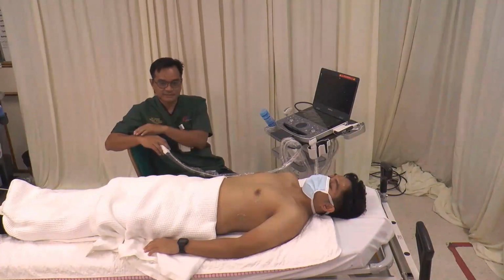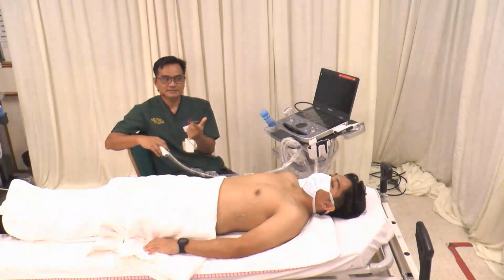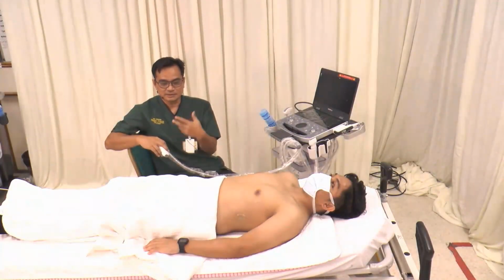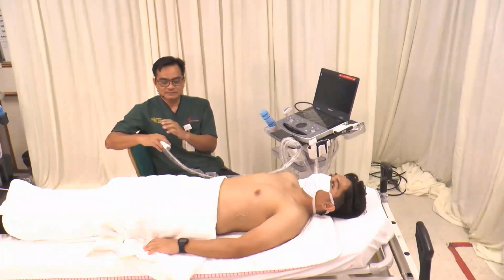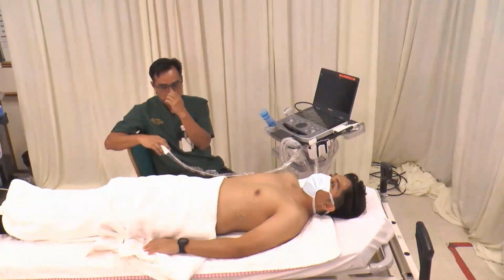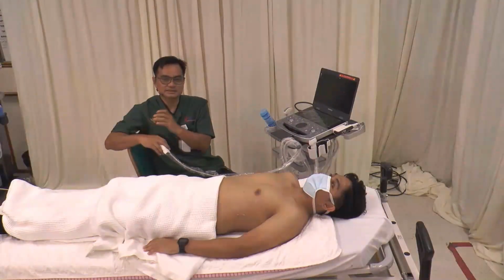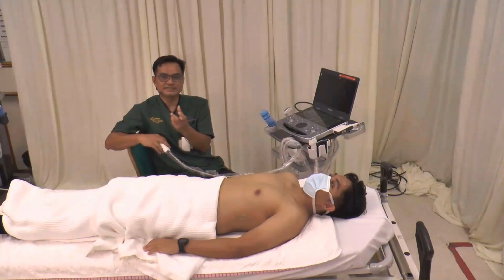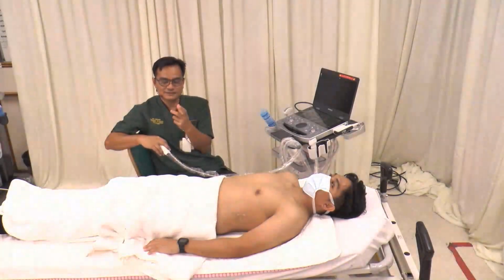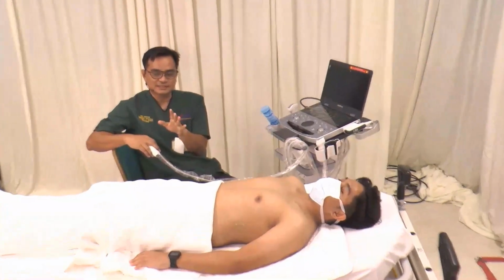Determine the fluid responsiveness. But I noticed something in COVID-19, because most of the time they are young, they hyperventilate, increase in what I call respiratory effort. Okay, so sometimes even those who are non-fluid responders, you can see there's some variability in VTI, meaning the IVC still collapses during inspiration.